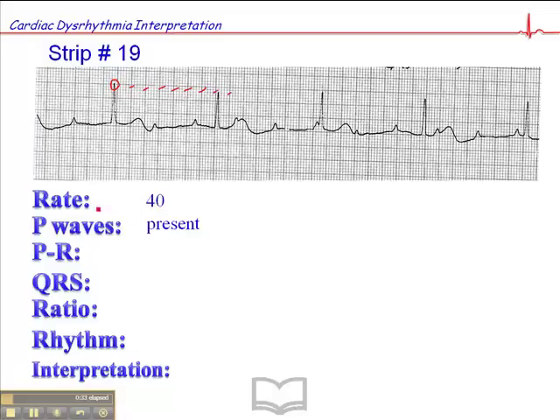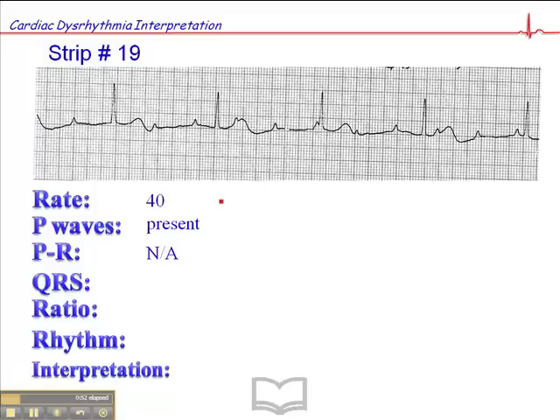We definitely have P waves. They're present and they're upright, and they seem to be pretty consistent in morphology. But the PR interval is not really applicable — there is no consistent PR interval. It's not consistent here; it's different from that one, and so on and so forth. So there's no real PR interval here. And the QRS is narrow — it's less than 0.12 seconds — and the ratio is not applicable because there is no PR interval.